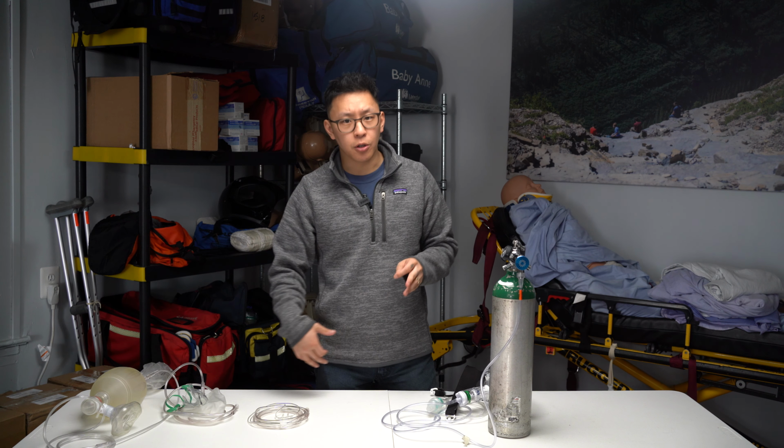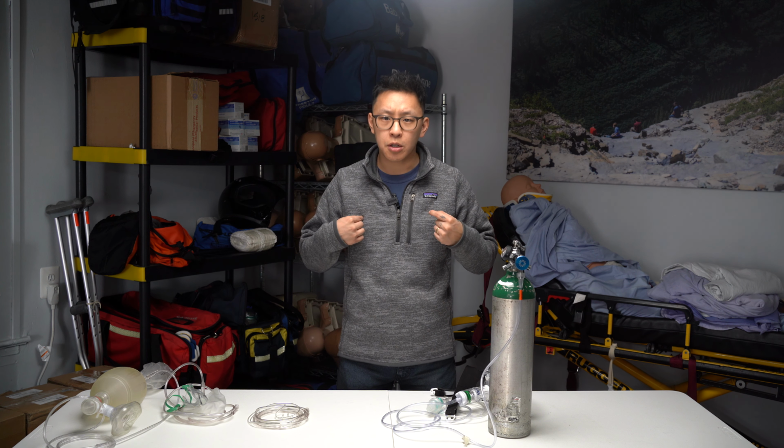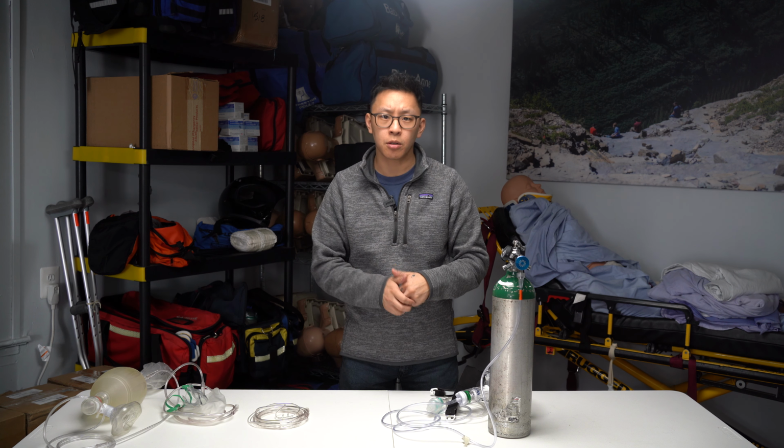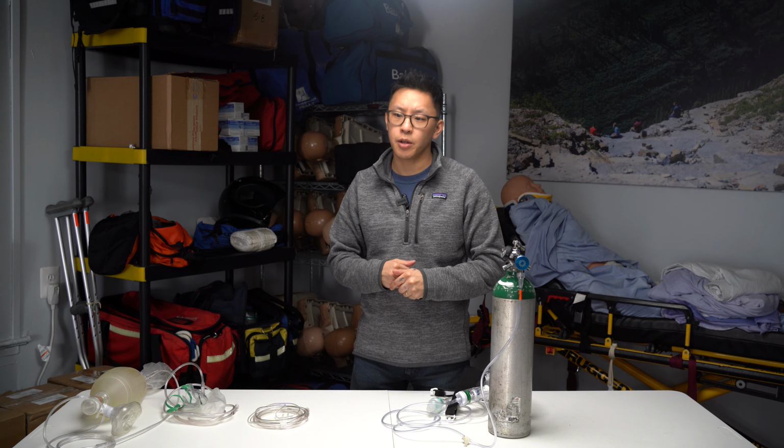And we have to ensure that this patient does not have a tension pneumothorax. So double check your lung sounds and make sure you don't hear diminished or absent lung sounds, because those would be contraindications to positive airway pressure and CPAP.